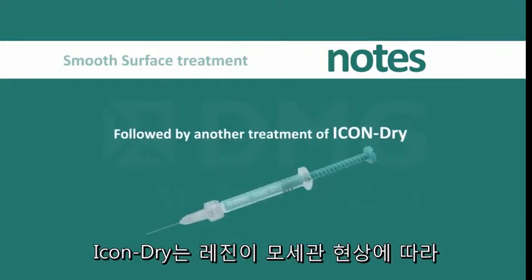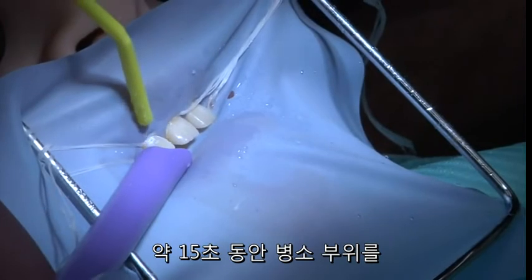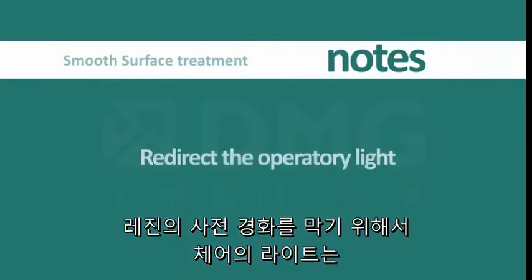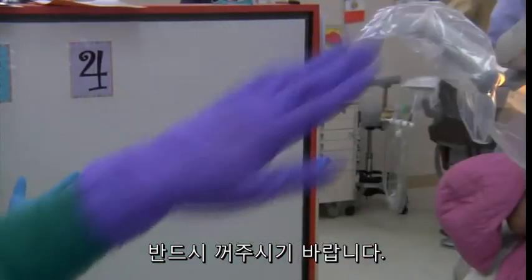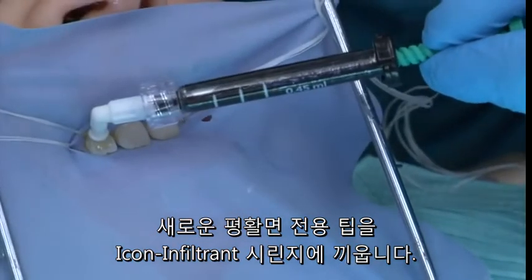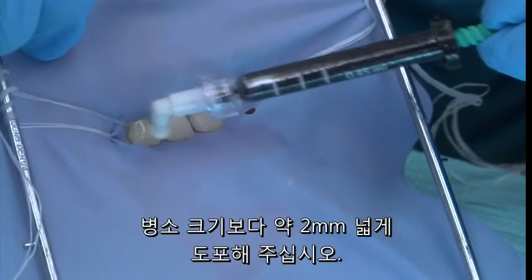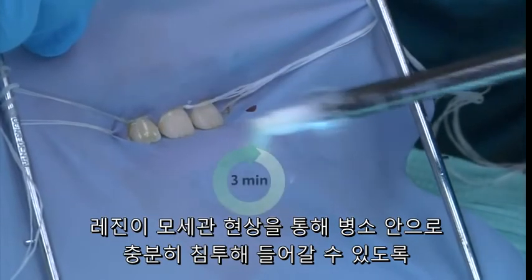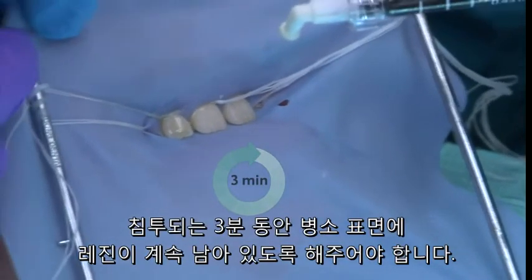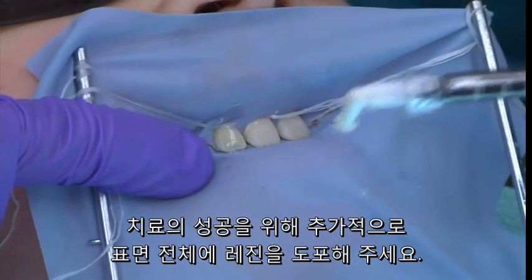Following any additional etch step, another treatment of ICON Dry is necessary for the capillary action of the infiltrant to occur. Thoroughly dry the lesion with oil-free and water-free air for 15 seconds. It is recommended at this point to turn off or redirect the operatory light so as not to prematurely cure the material. Place a new smooth surface applicator tip onto the syringe of ICON Infiltrant. The resin is extruded from the applicator tip two millimeters beyond the margins of the lesion. The infiltrant is allowed to sit over a three-minute period while the resin penetrates into the affected area via capillary action. Be sure that the lesion surface appears wet at all times during the three-minute infiltration, and if necessary apply additional infiltrant.